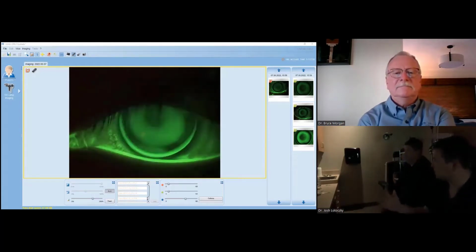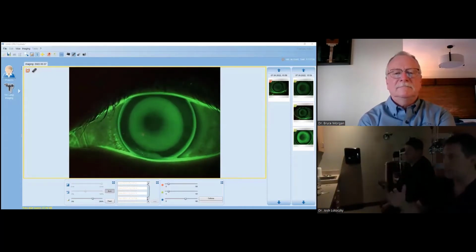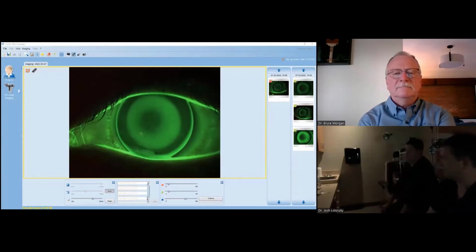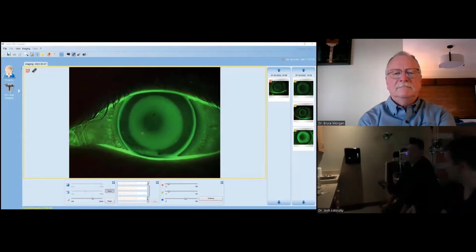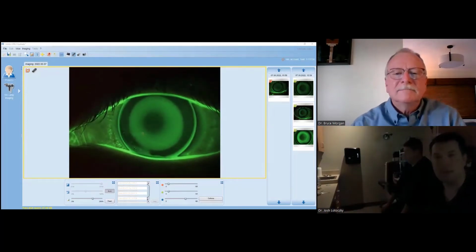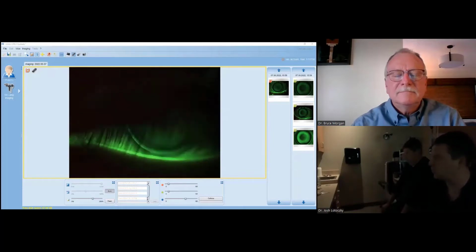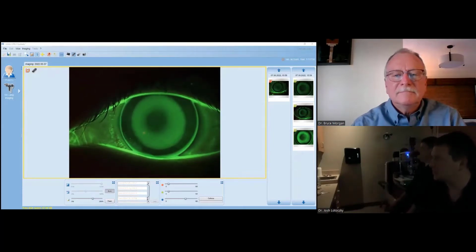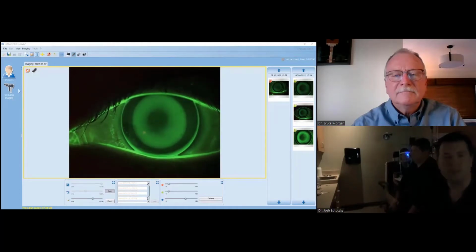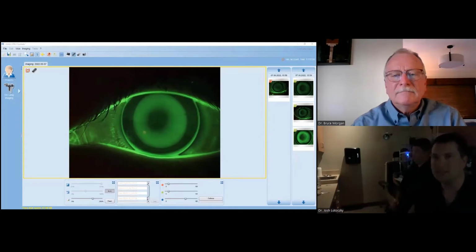then in that case, is the reverse curve just sitting the lens too high off of the eye? And do we have too much sagittal depth in the contact lens? I mean, that's what I would think. My intuition would say, even though this doesn't look like that beautiful pattern that we see, and we can start seeing it come in more, it's still probably not going to drop down enough and have that fluorescein dissipate enough for us to go, yeah, that's the ideal fit.